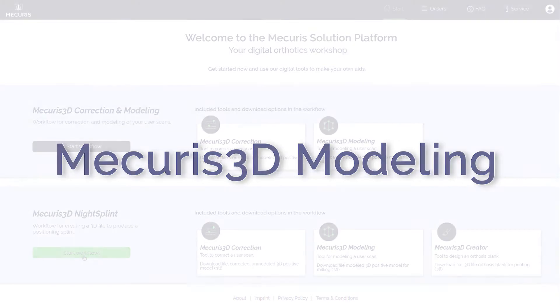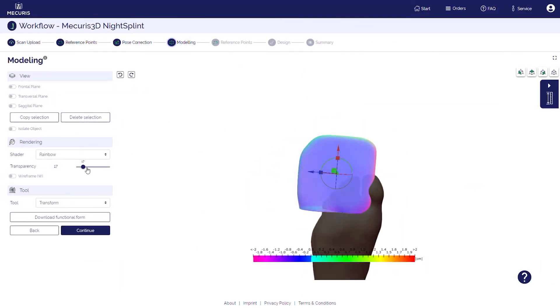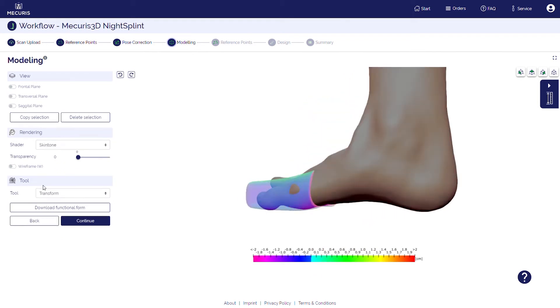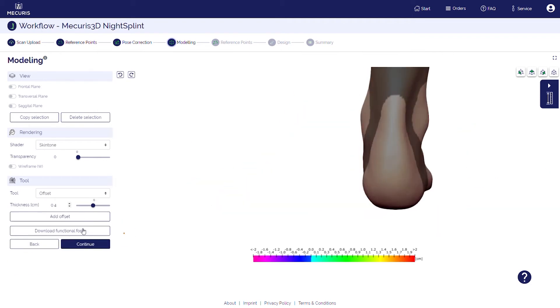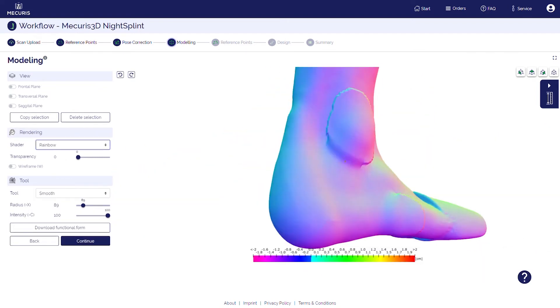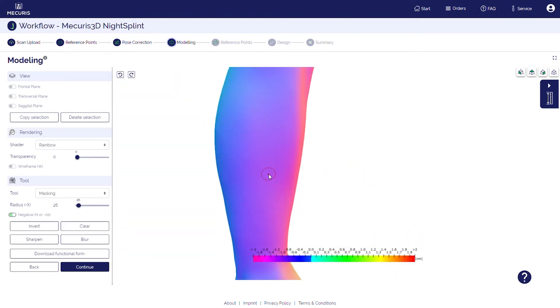The Mecuris3D modeling tool enables you to digitally create a functional form online. For that you have a full toolbox of 3D modeling functionalities at hand. You can easily bring in a forefoot extension, build up or remove material, smoothen corners and edges, and even bring in joints. All of these functionalities are available in our intuitive user interface.